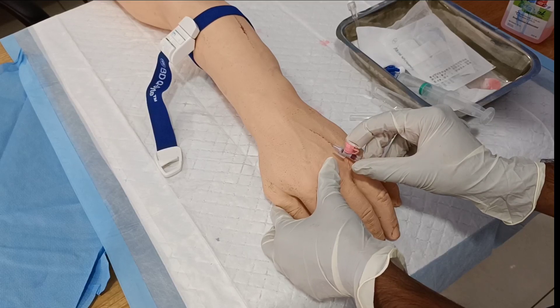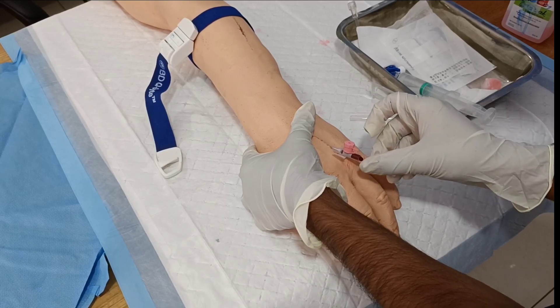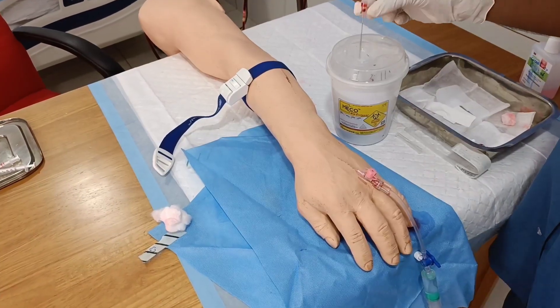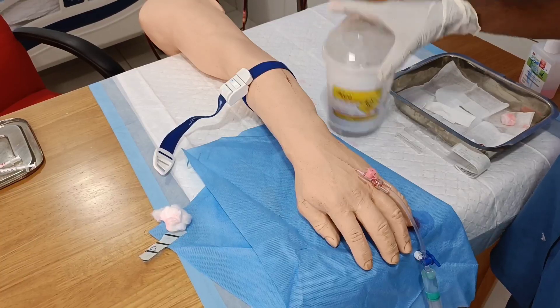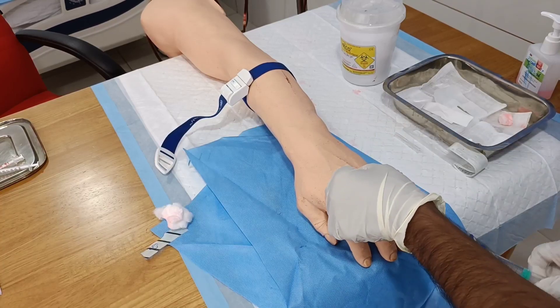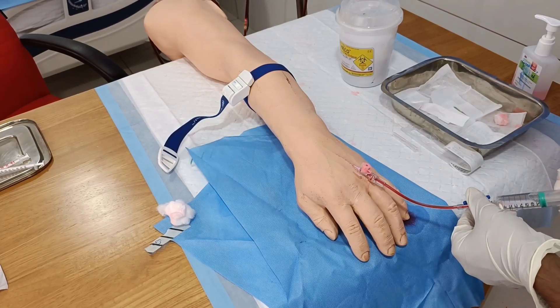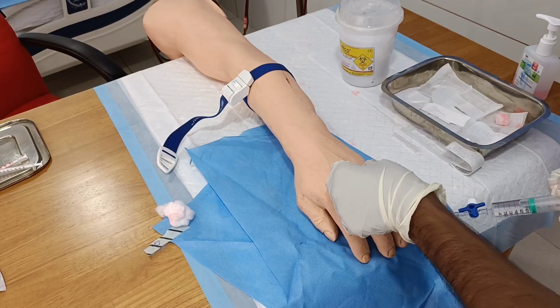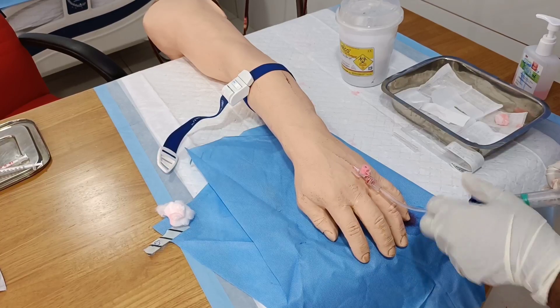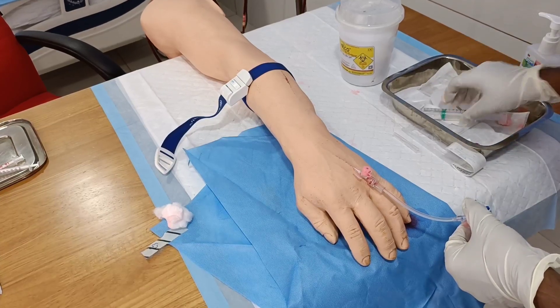Apply some pressure to prevent spillage. Slowly withdraw the needle and discard it in the sharps container — a sharps container is essential. Connect the IV extension with syringe to the cannula. You can then check patency: aspirate to confirm blood return, then flush. If there is any swelling or the patient complains of pain, that can be identified at this stage.